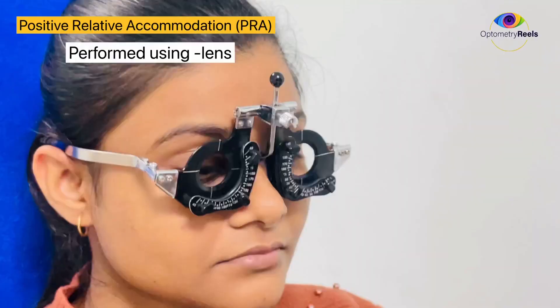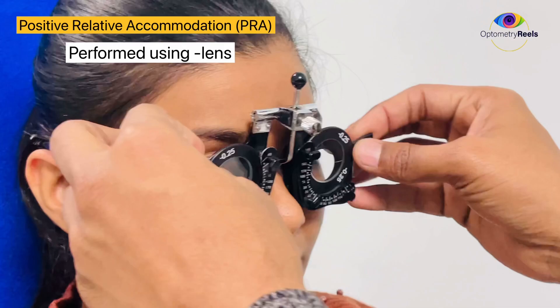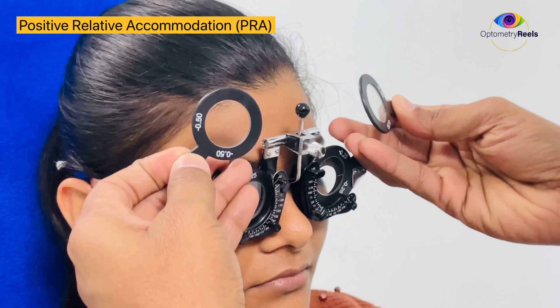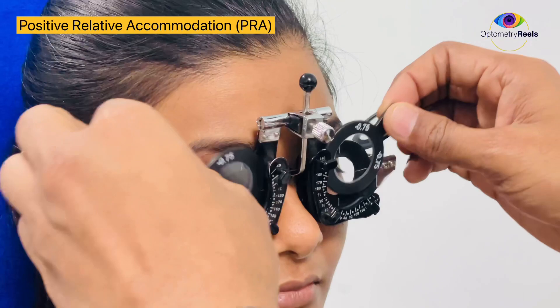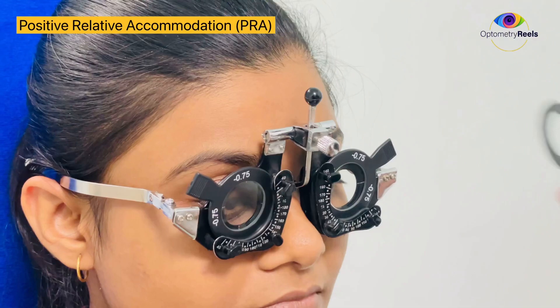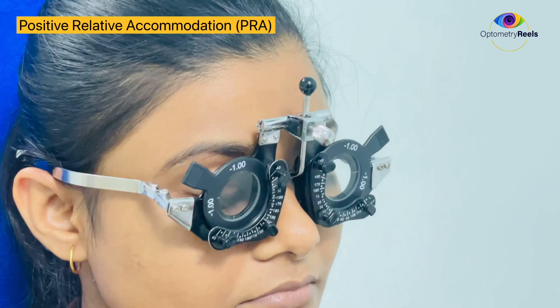For the PRA test, we start with minus lenses. The first lens I'm going to put is minus 0.25. I'll remove this lens and then put the next lens of higher value, so the next lens will be minus 0.50. Make sure that you are removing the previous lens first and then inserting the next one. I'll keep on increasing until the patient starts reporting blur.